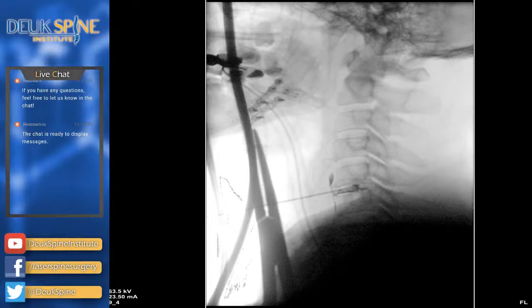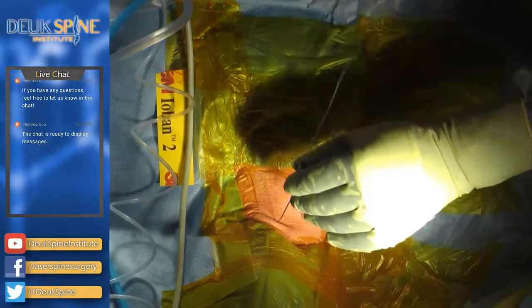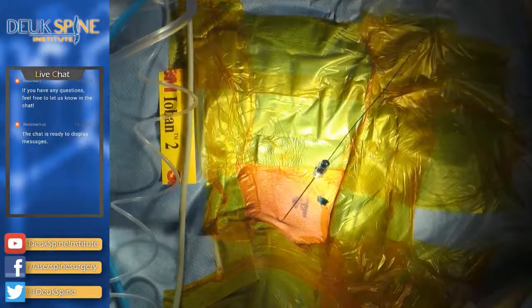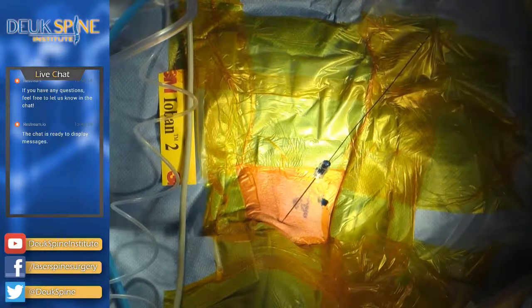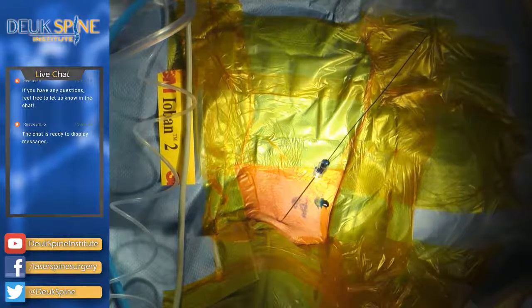All right, well, there you have it. Nice job. We are in the proper disc, the 5-6, and I'm going to place my guide wire now that I've done my discogram. And we've confirmed the tears and the herniation. We can see them on the x-ray. 2, 3, 4. Are you concerned? Yeah, I just want to make sure. There's nothing you're concerned about, right? Everybody's certain. 2, 3, 4, 5, 6.